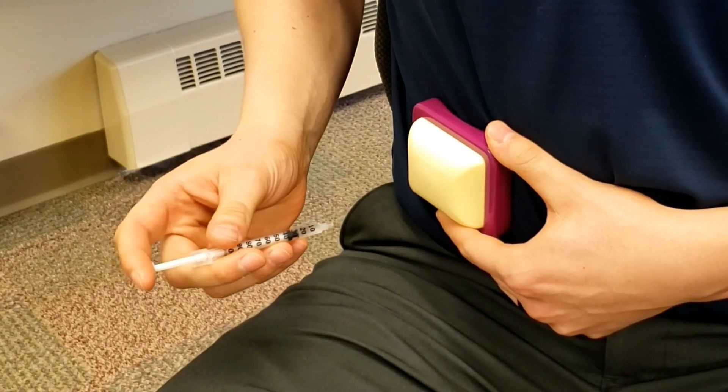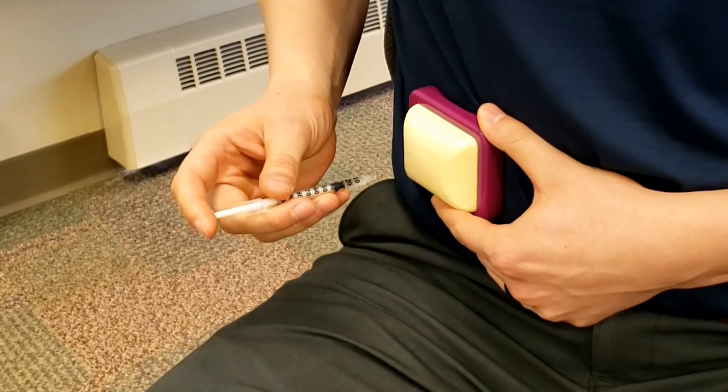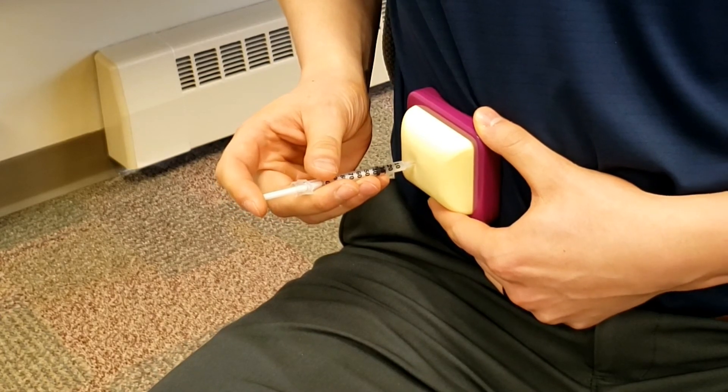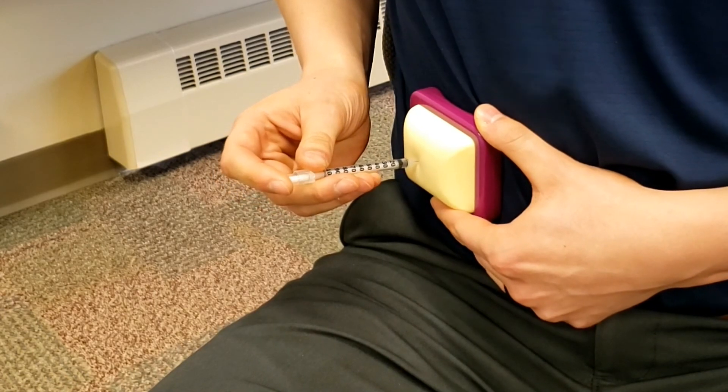To perform this injection, you need to poke the syringe straight into your skin at a 90 degree angle. Once you have pushed the syringe into your skin, push the plunger all the way in to inject the insulin. Count to 10 before removing the syringe from your skin.